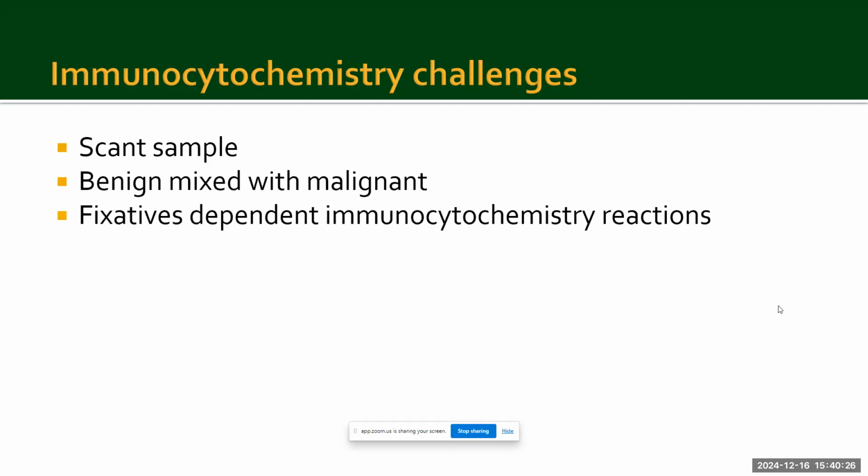Another thing, we do not really talk about the fixatives that we use in the cytology sample, which can also give rise to a lot of false negative immunocytochemistry stains. Specifically, I have experience with a lot of TTF1 negative adenocarcinoma in cytolyt fixed cell block material. So there are many challenges that you face, and I would say always go back to H&E, look at the lesional cells before you start interpreting immunocytochemistry in any cell block sample. So H&E is still the key, like in all other aspects of pathology. That's definitely, and I don't think it's going to change anytime soon, Neharika.